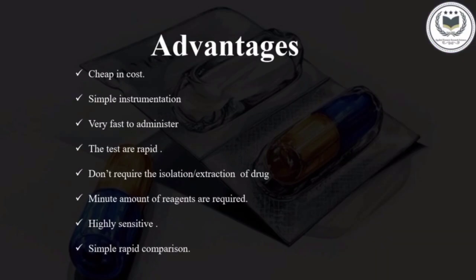Let's see the advantages. It's cheap in cost, instrumentation is very simple, the procedure is very fast, rapid results are observed, and there is no need to extract the sample. The reagent is required in a very minute amount, and the test is sensitive and rapid.